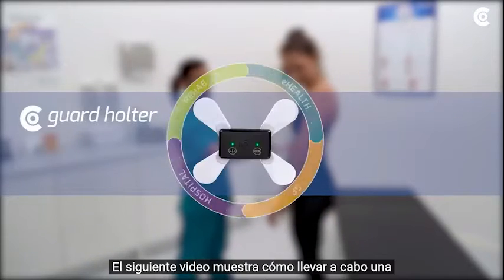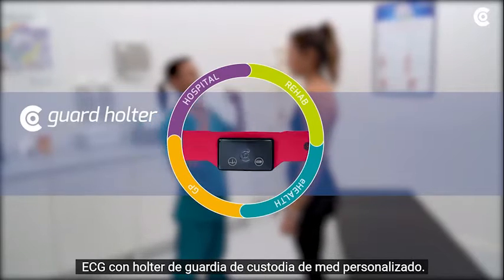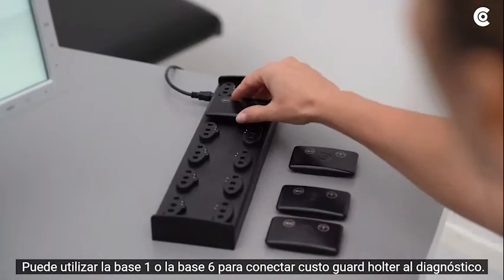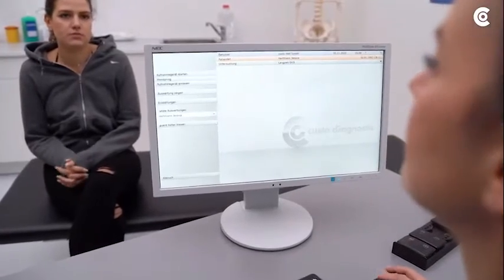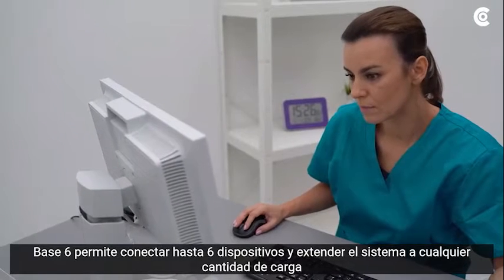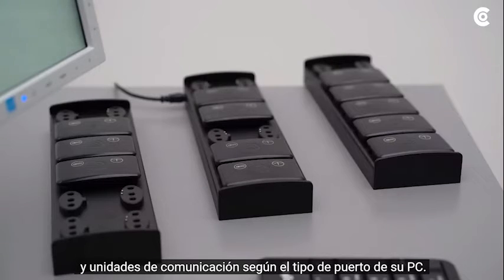The following video shows how to carry out a long-term ECG with Custom Med's CustoGuard Holter. You can use Base 1 or Base 6 to connect CustoGuard Holter to the diagnostic software and to charge the device. Base 6 allows connecting up to 6 devices and extending the system to any number of charging and communication units, depending on the type of port on your PC.